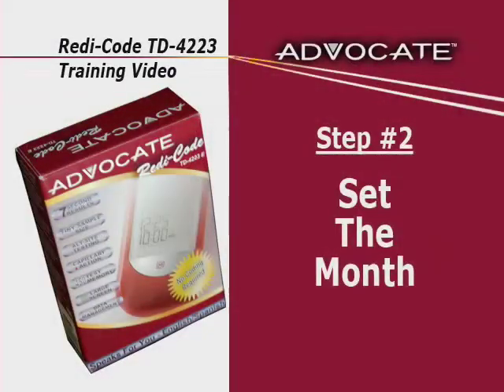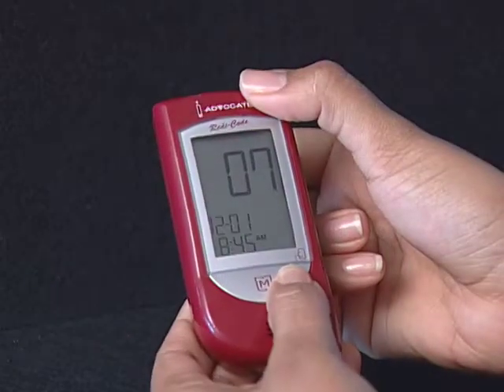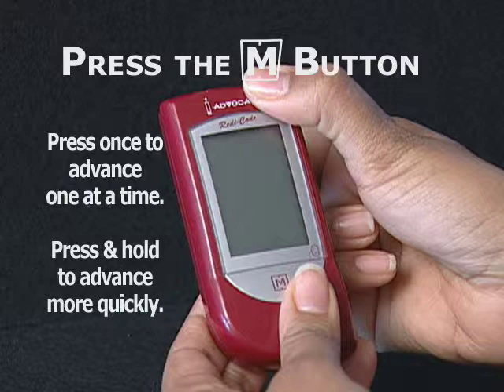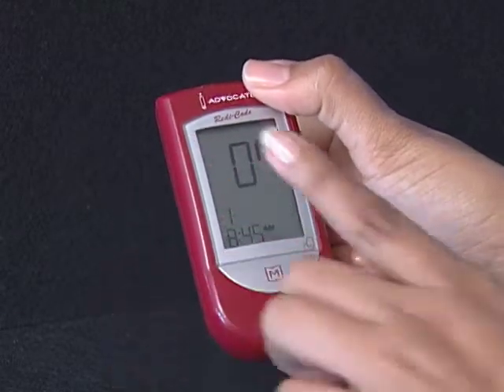Step 2: Set the month. Press and release the M button until the correct month appears. To move faster, hold the M button down. With the correct month on display, press the Set button and then the day segment flashes.